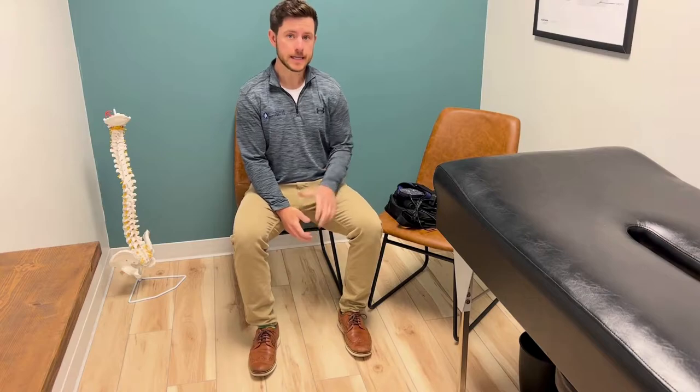Hello, I'm Dr. Evan Norum with Advantage Neuropathy, and this video is on our low-level light therapy boot and how to use it.